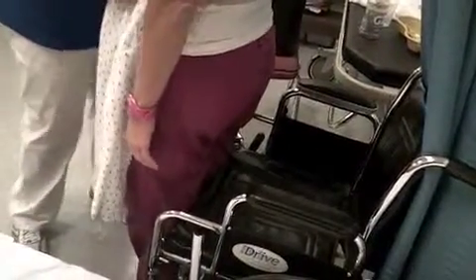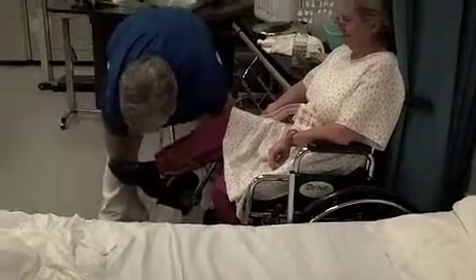She's very close, we're very secure. Let's turn around. Back up until your legs hit the chair. Let me take a peek — I am looking to see that their legs are against the chair. On three, I want you to reach back for your chair, stick your butt out, lean forward, and sit. One, two, three — stick your butt out, reach for the chair. There you go. Now let me check your back to be sure your buttocks are in that chair well. And they are. Let's swing this around — foot rest down, foot supported.